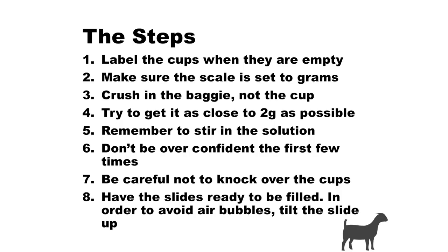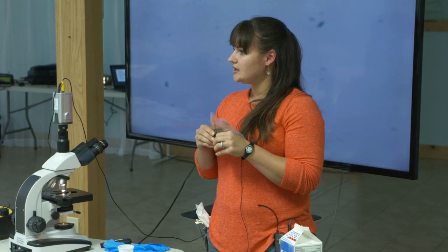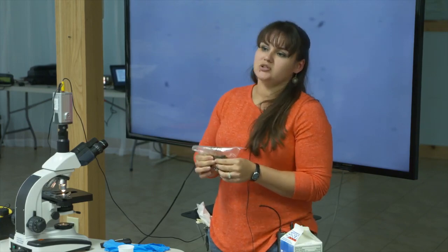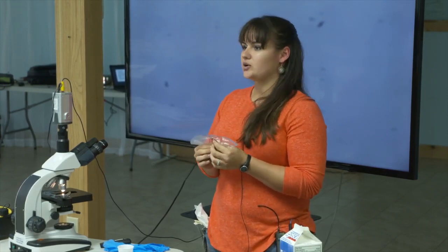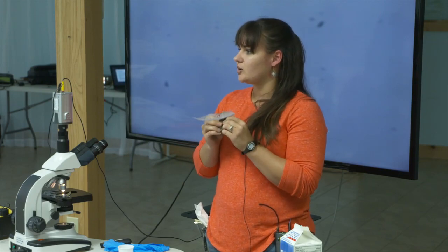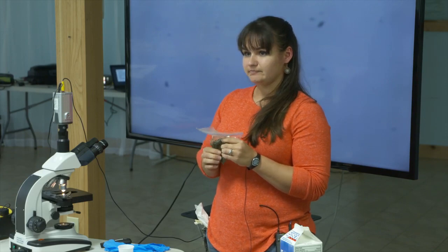When you've got everything in the baggie, your baggie is your best friend. You can sit there and break up the pellets, get everything meshed around. Think of it this way: every pellet that comes out of the animal is going to be a little bit different — one may have more of a certain type, parasites are going to be in another one. So when collecting from the animal, don't get just one or two pellets. Crush everything up inside the baggie so you're not working off of just one or two pellets.